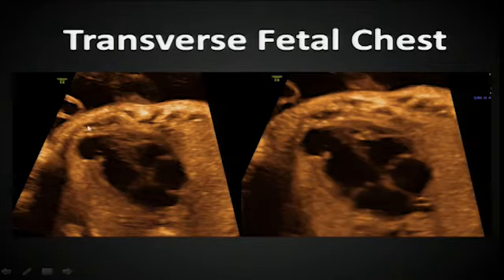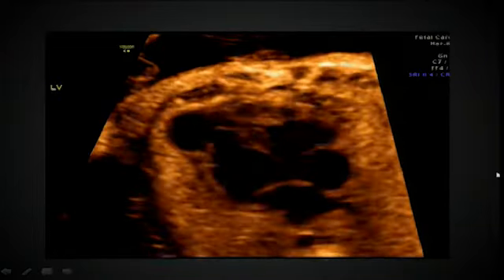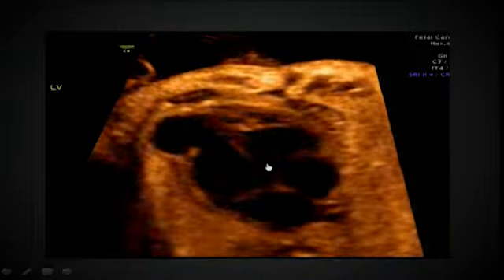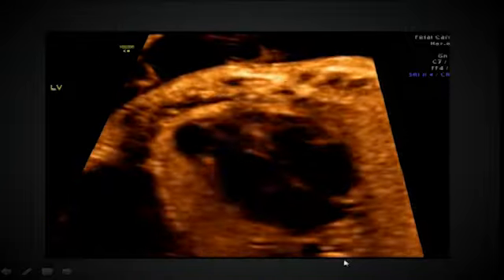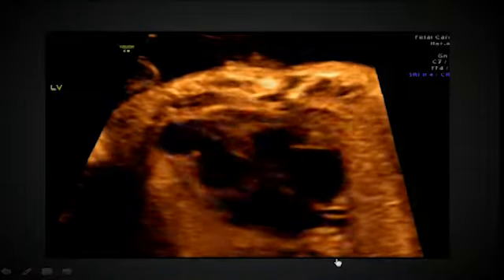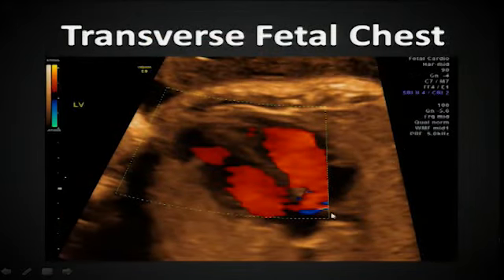So we're looking from posterior to anterior, left to right. Looking at our four chambers: left atrium, left ventricle, right ventricle, moderator band, so that is morphologically the right ventricle, anterior chest wall. And then this in real time. So left atrium, left ventricle, right ventricle, apex, anterior, and then looking posteriorly. Anything catch your eye? Of course, let's put color on it.